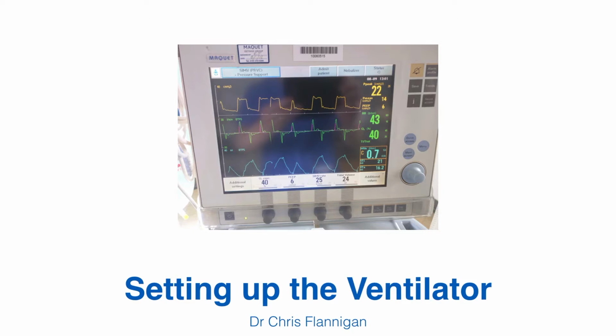So you've told the ventilator what gas you wanted to blow into the patient, how many times per minute, how long to deliver the breath over with the inspiratory time, and how long not to ventilate and allow the patient to expire for the expiratory time. And you've set the ratio of inspiration to expiration with the I:E ratio. A couple more things to set before you're finished.